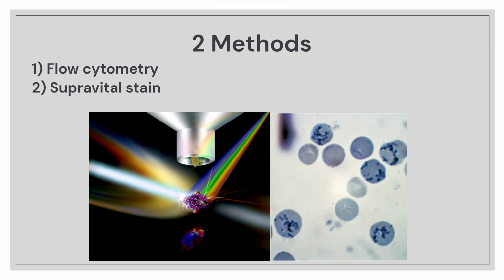The stain allows cells to be recognized by the blue intracytoplasmic precipitate ranging from the appearance of granules to a network of reticular material. The principle is the RNA within ribosomes reacts with basic dyes such as azure B, brilliant cresyl blue or new methylene blue to form blue precipitate. This manual technique is useful in under-resourced laboratories.